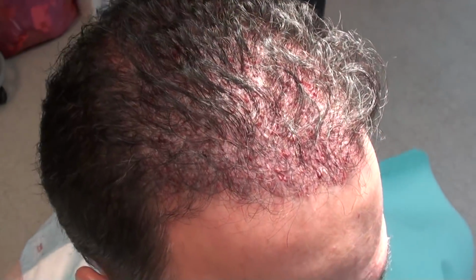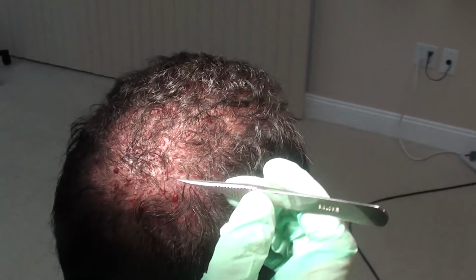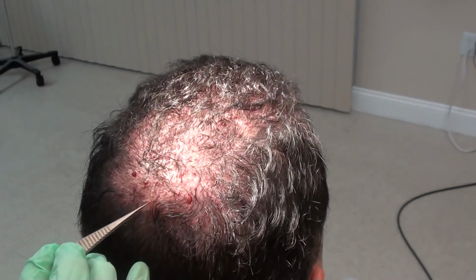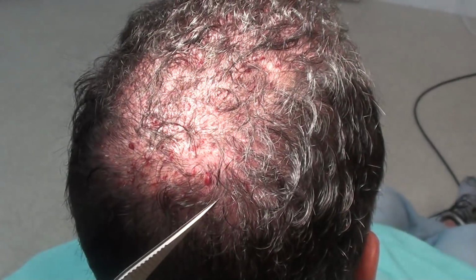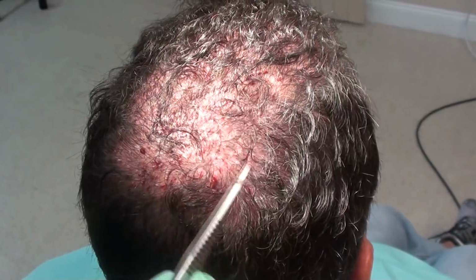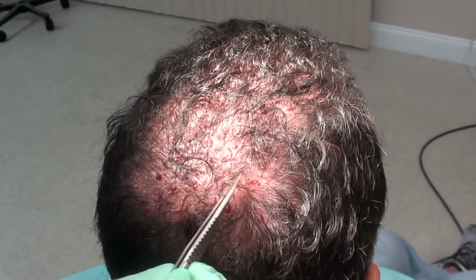And then we went in the crown, and we restored into the crown, built a spiral all the way around. So these grafts came in at an angle, going like this. These are going this way. These are going this way. You've got it built all the way in and through the existing hairs all the way around. So you can see those little grafts in there. Those are all little grafts that we put in there.